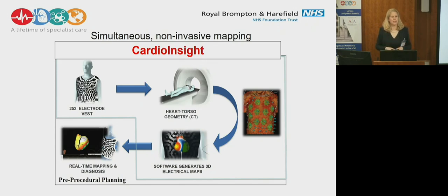Let's say the patient has rare ventricular ectopy, but is very symptomatic. And you could wait for it to happen. You could provoke this patient, for example. You could challenge them with meeting their favorite relatives, or have them being stressed by a stressful phone call, 3 cups of coffee, IV isoprenaline, whatever you could think of. You could make them exercise and see exactly every heartbeat. Every single heartbeat can be reconstructed. You would just need to select that on the system.